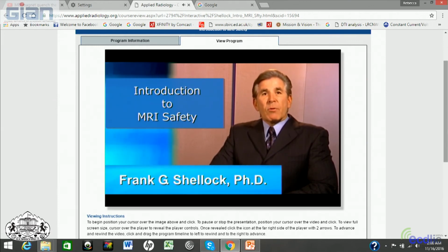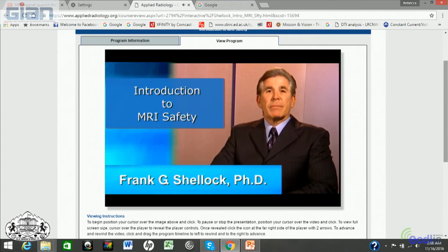The MRI environment refers to the area in and around where the MRI system or scanner is located. To ensure your safety and to protect others, all individuals who need to enter the MRI environment on either an occasional or regular basis must undergo proper training regarding the potential hazards and dangers that are associated with this area. It should be noted that while many MRI safety issues exist, the information presented in this program specifically emphasizes the aspects of the MRI environment that directly impact those of you who occasionally or periodically enter this area.